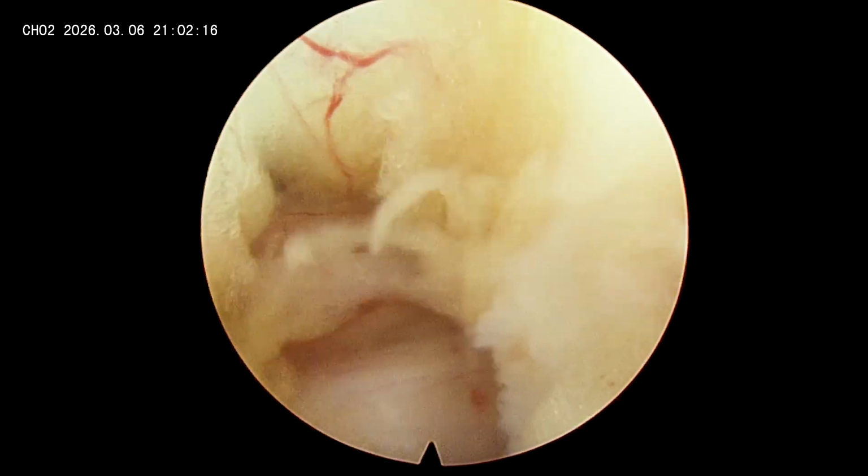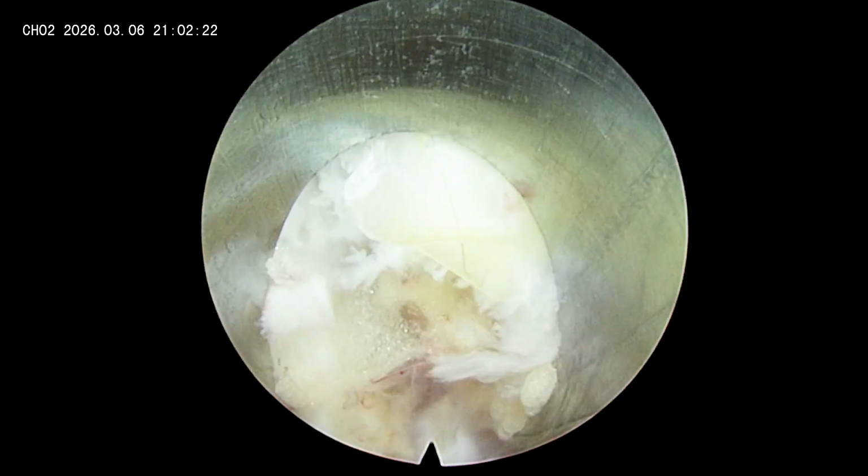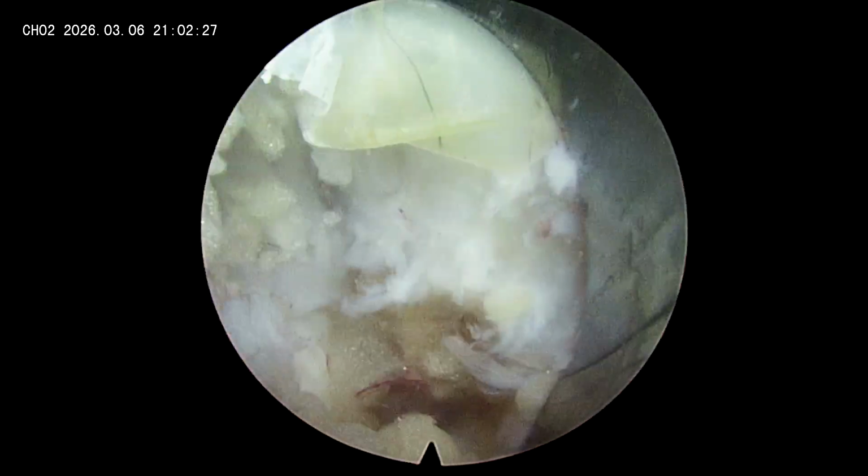So the tip here is to identify the lateral border of the traversing nerve root. Unless you see it, don't touch the structure lying in front of you. It might be a root as well, so don't poke it.